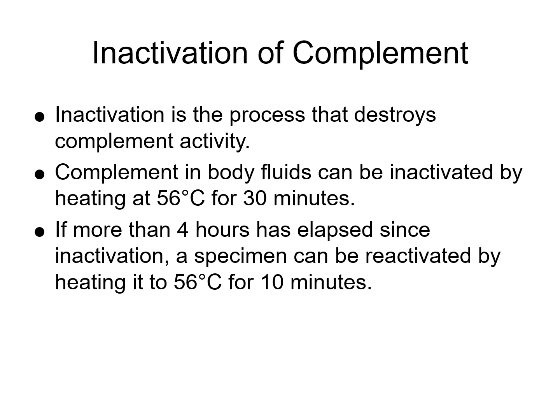Complement inactivation. So the purpose is to understand the inactivation of complement in the body fluids. This helps to ensure accurate serology testing by controlling complement activity. The definition: inactivation is the process that destroys complement activity in a specimen. Complement activity, if not controlled, can actually interfere with certain serological assays.